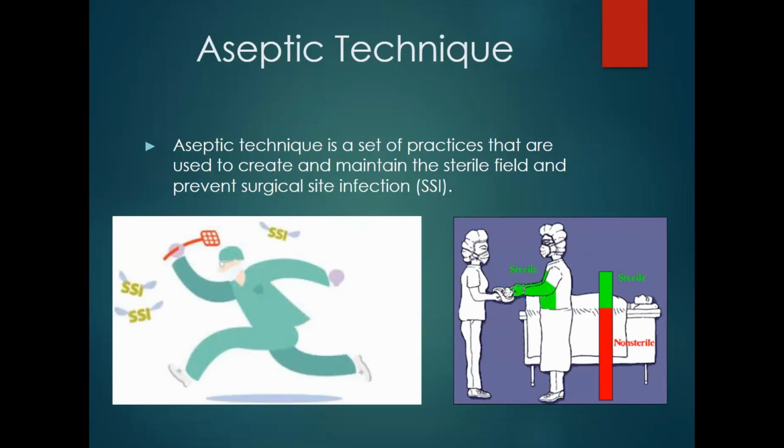So you do have to speak up. If, for example, we put on your gown and your gloves and you turn around and accidentally touch the video monitor for a laparoscopic case, you need to speak up and tell whoever is in that case with you, I touched the monitor with my right hand. Simple fix. The circulating nurse can take off your top glove, or take off your glove if you haven't double gloved yet, and then the surgical technologist just puts on another glove.